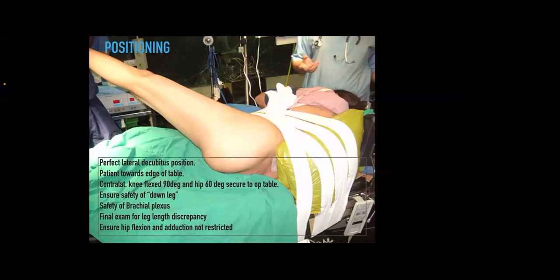Later, once it is draped, you may not be able to feel that. So if you have done that preoperatively, you will probably be able to better understand the length. So ankle and ankle, malleolus and malleolus matching, knee and patella matching, you should do it before draping, so then you can understand how you do it while in the drapes after the implant setting.